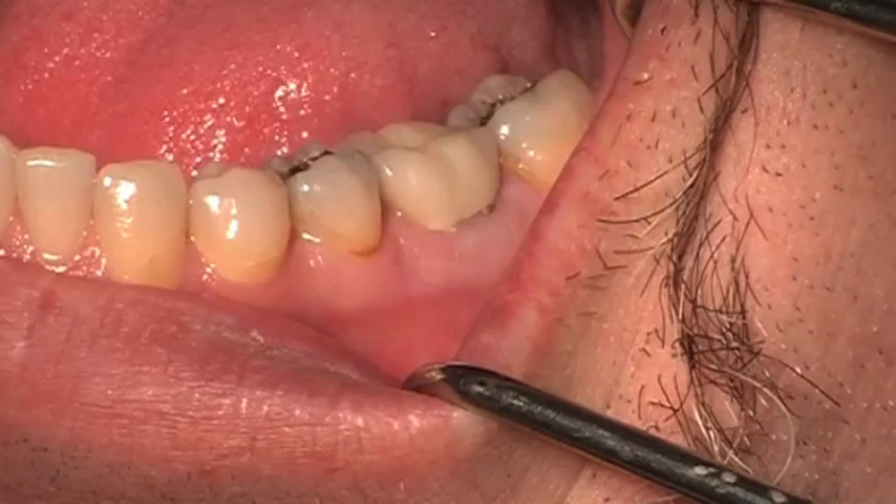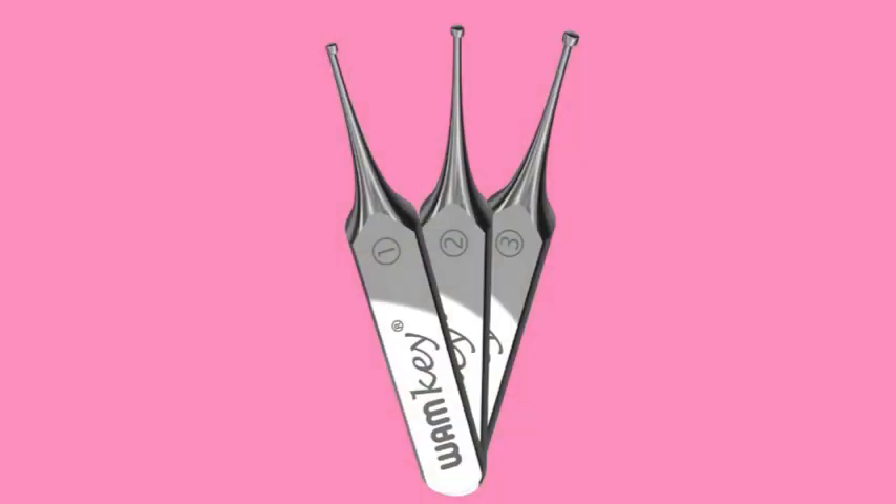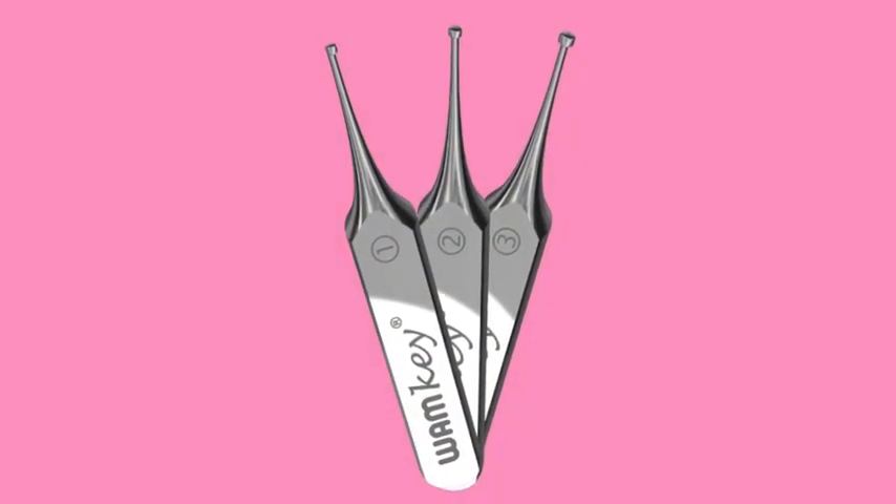Here we have a first molar crown that has recurrent decay. We told the patient that we really can't tell how much decay is underneath the crown, and we determined that we would remove the crown atraumatically. Here we want to demonstrate the use of the Whamkey.